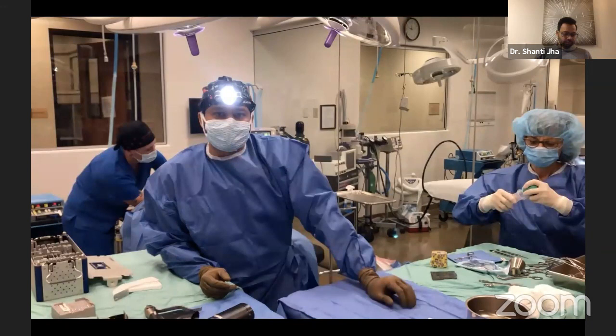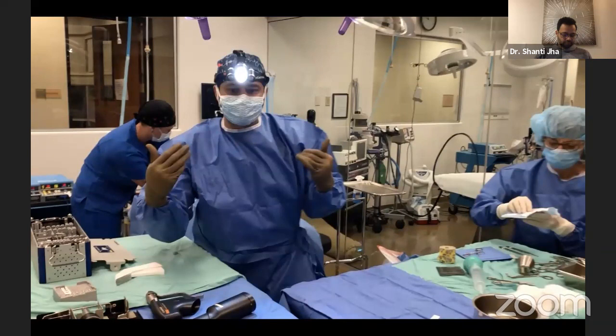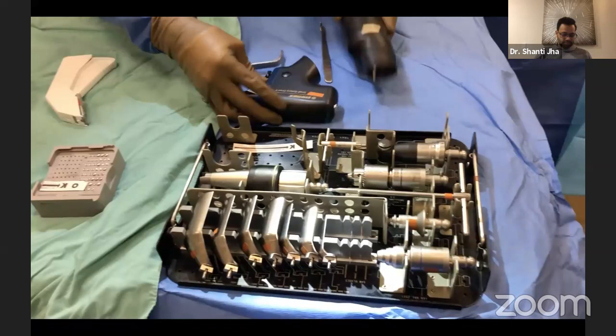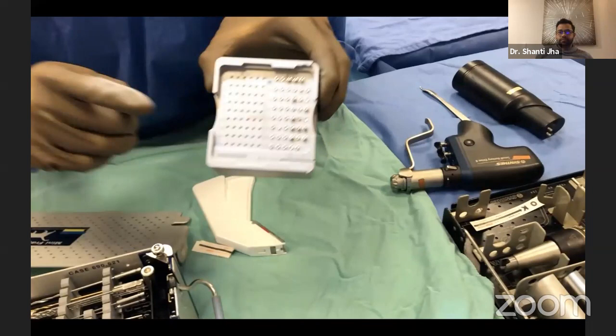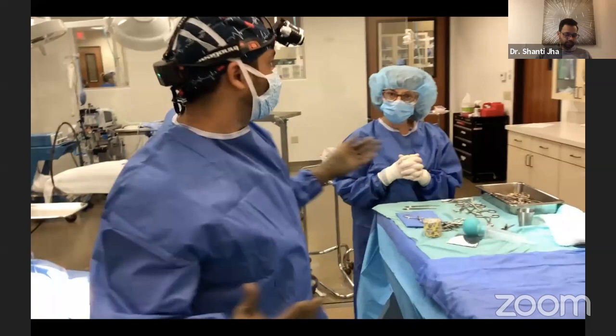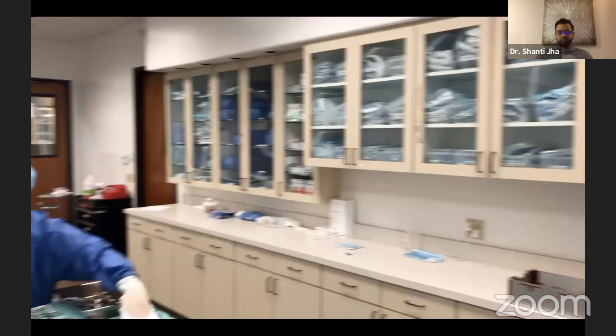Normally, this is the setup right here: the drill, and of course we are using this mini fragment set, and most of the dogs will get a 2.0 screw set. So we'll go ahead and do the repair. As you can see, we can pan all around. So that's the surgery setup. And if VetInna or you guys want to see a real-time surgery, we can arrange that at a future date. All right, see you.